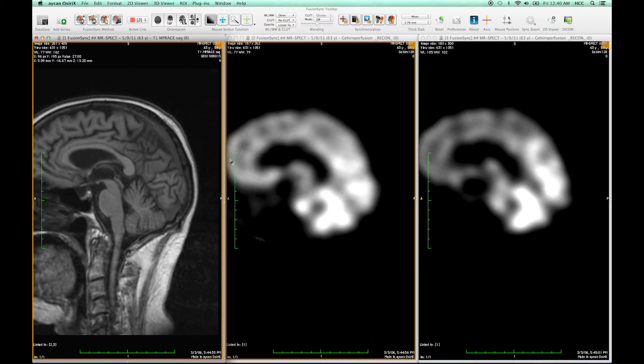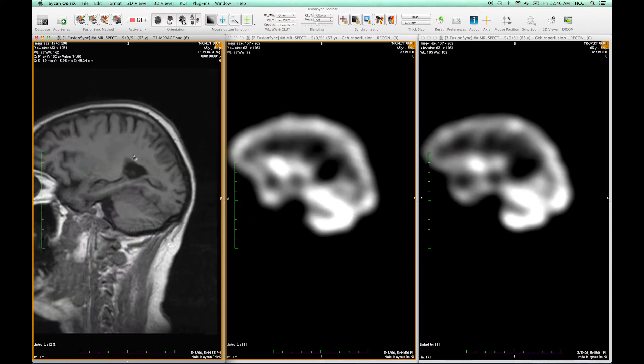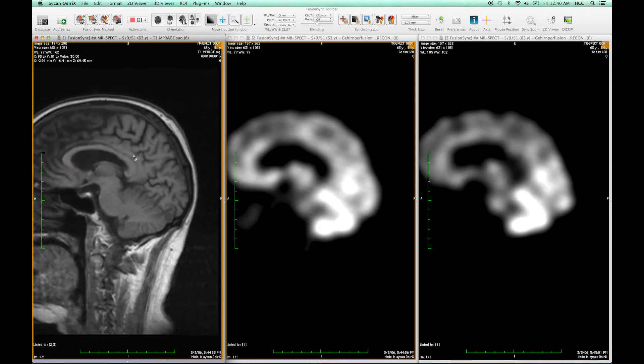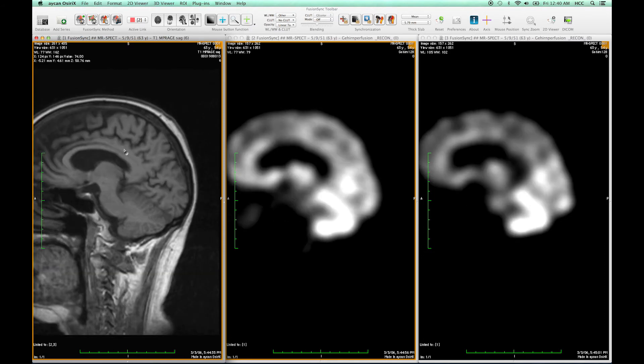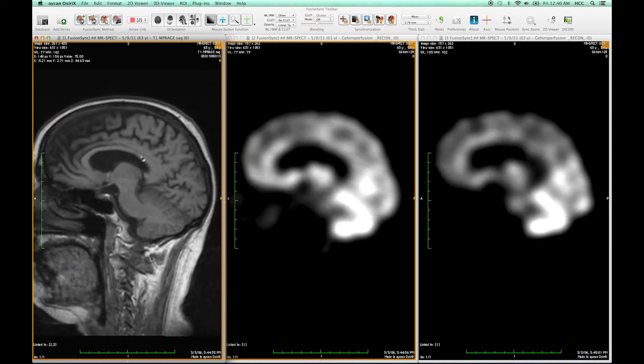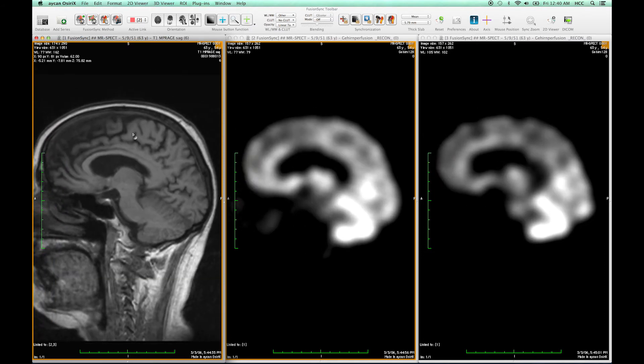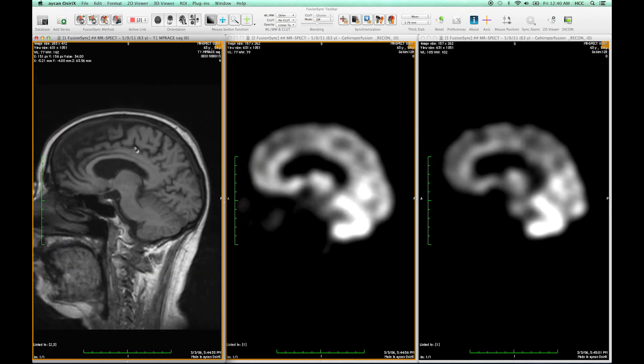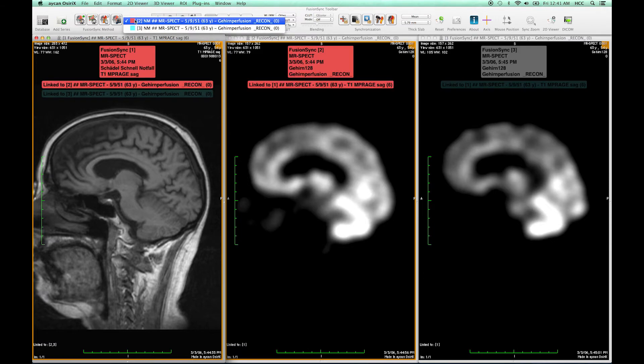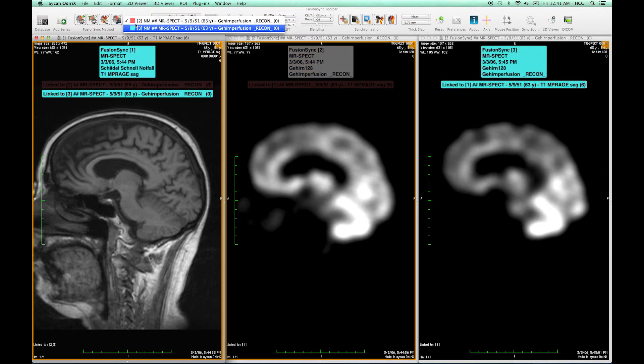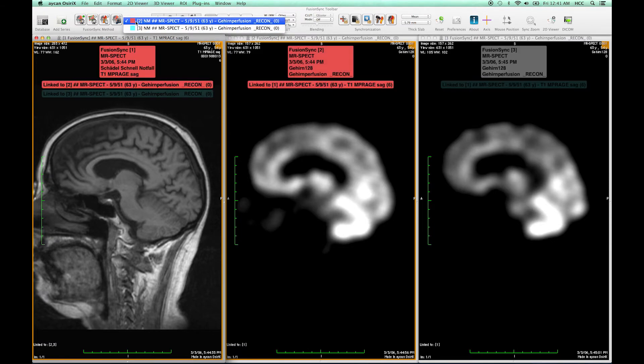And here you see that now also this image is in the same coordinate system as the other ones. Now FusionSync already registers the new image and now I can switch between both of these by selecting the appropriate active link.